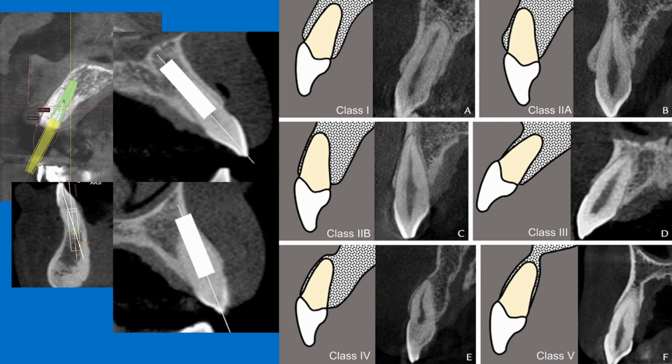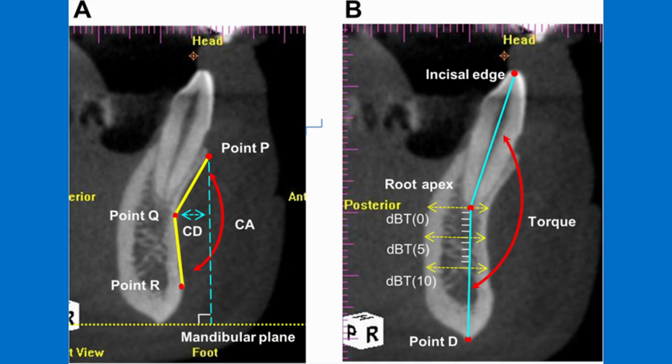To fabricate a screw-retained implant prosthesis, a screw access hole must be formed on the lingual side. From an aesthetic perspective, screw access holes cannot be placed on the labial side in anterior implants. However, in many cases, it is not possible to place fixtures so that the screw access hole emerges on the lingual side. Based on bone resorption patterns after tooth loss, it is often impossible to place fixtures in that manner. In the mandible, however, it is relatively easier to place fixtures toward the lingual side. But in the mandible, there is a higher risk of failure during the initial stage of implant placement.